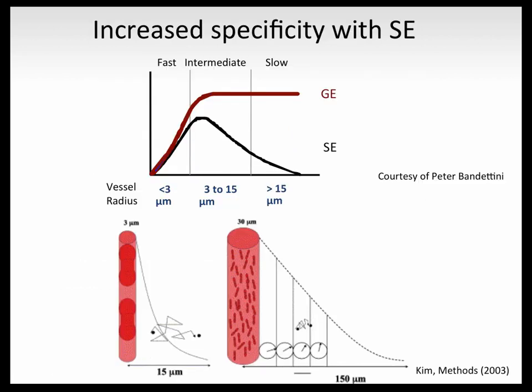So the reason that this works is that the larger veins also have a susceptibility associated with them, and so they also create their own little magnetic field gradient, which spin echo can actually compensate for, basically, for the larger veins, but not so much for the smaller veins. So it ends up being sensitive to smaller veins, whereas gradient echo, which is the standard stock sequence, is actually sensitive to all of the bigger veins as well.